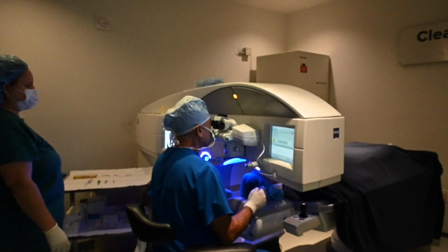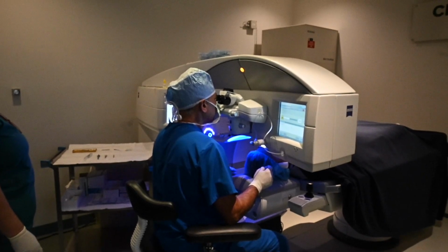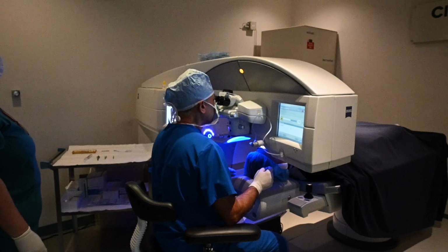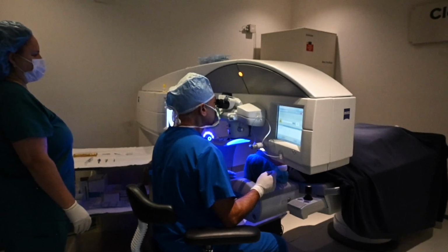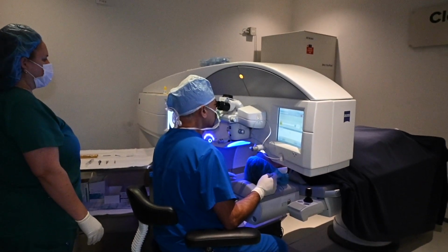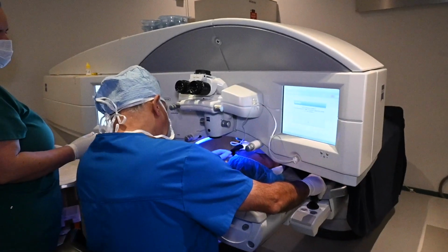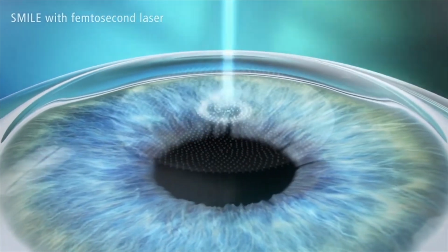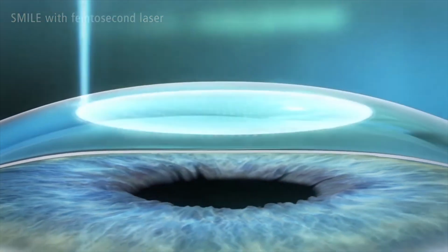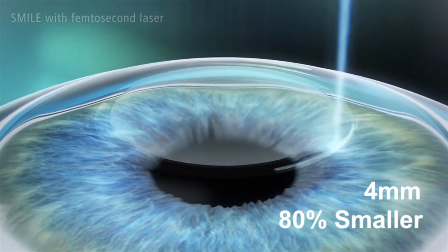But anyway, now that we've centered, then the interface will come towards the cornea, or the cornea will come to the interface. And once the apposition is there 80%, we'll apply the suction. You don't feel it, it's painless. And in the next few seconds, which can vary from 16 to 23 seconds, the disc will be created. First, the lower or posterior surface will be made, then the anterior or superior surface, and finally the cap. Once this is done, the laser is taken out and the microscope brought on.